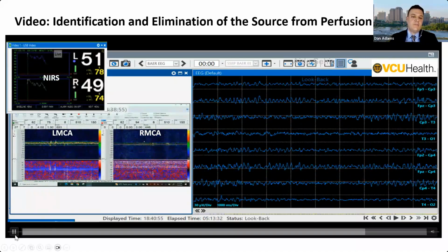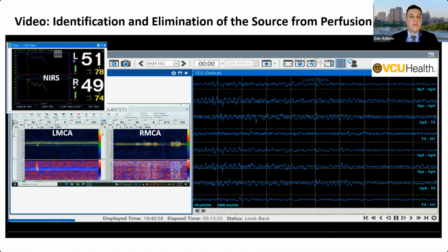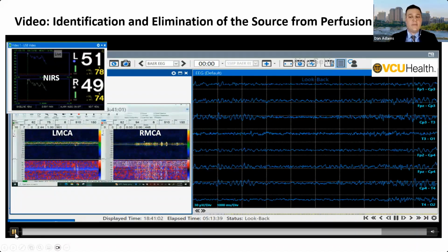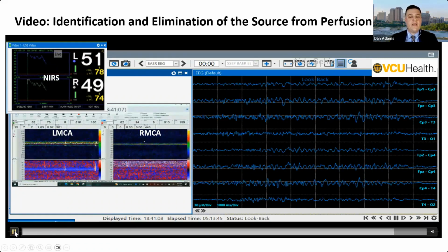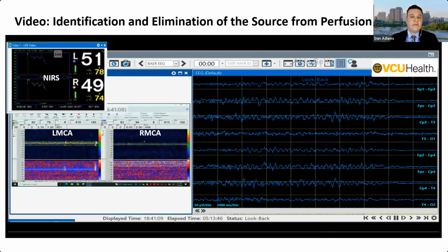Our guidelines and protocol dictate that if we observe simultaneous changes in 2 or more modalities independently, our team must act immediately. As Aida noted in the previous case, if uncorrected, major embolic events have the potential to cause severe neurologic injury to the patient.